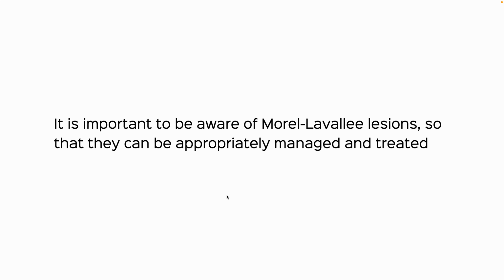In private practice where I am, we don't see them too often because the acute ones typically occur with significant trauma. But nevertheless, we should be aware. We should mention these in the report. Try and classify them if possible so that they can then be appropriately managed and treated.